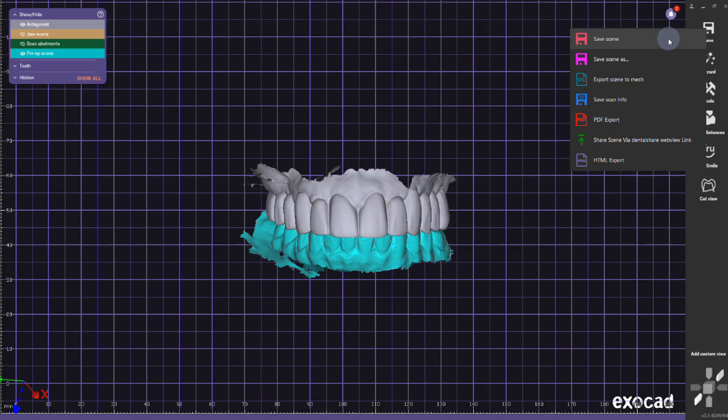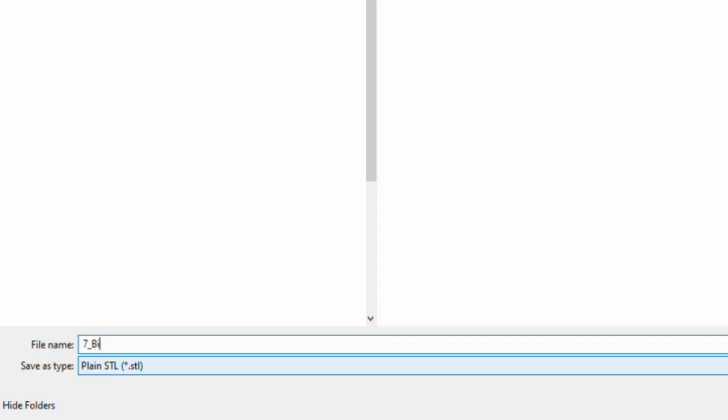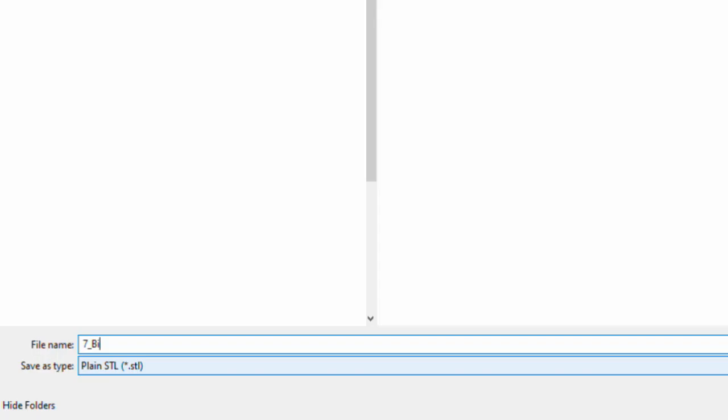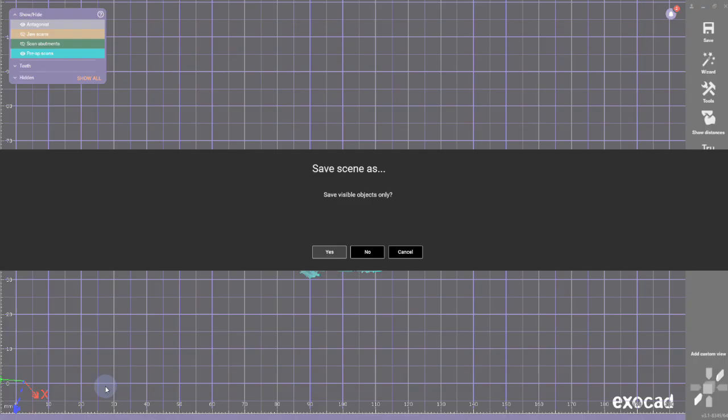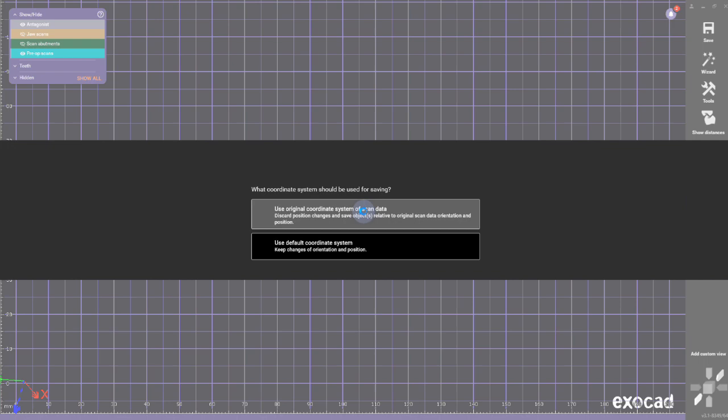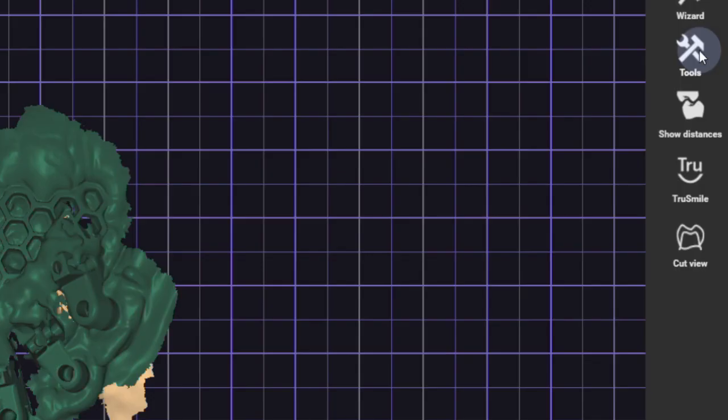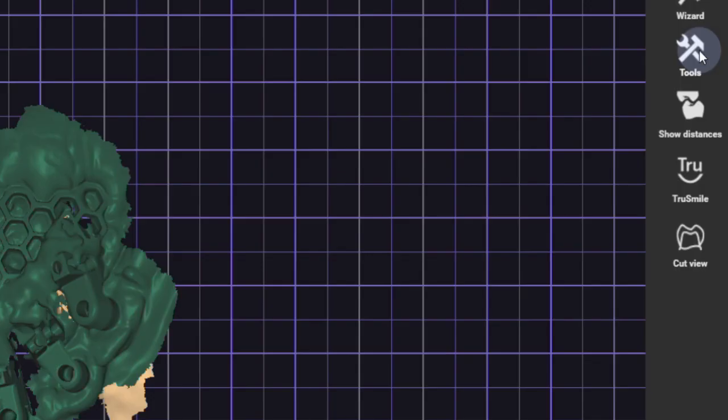Here, in this case, the antagonist is a little bit offset, so I am right-clicking on it, click on correct antagonist, and move it a little bit to have the correct occlusion. This I'm going to save out as a bite scan, and you will see later why this is important. So the upper and lower arch is going to be a bite scan—yes, the same orientation.